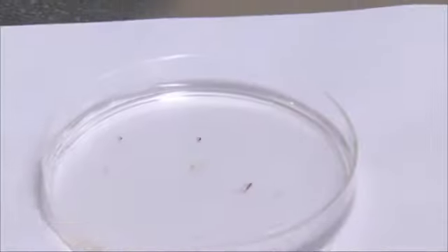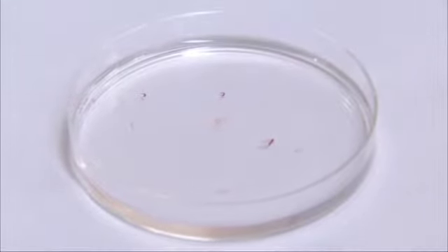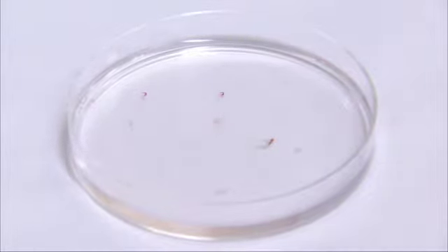Oh, that's too bright. There you go. That's good. So you see some of the core material, I believe. Yes, you can get some white tissue. Not so much, but I think it's enough. Are you sure? Are you going to guarantee?